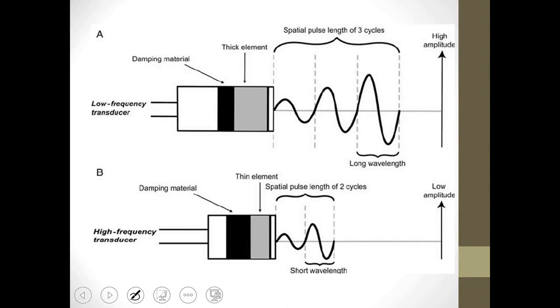It will stop completely. So you have indeed applied damping to the vibrations of your crystal. The damping block located behind the crystal serves to dampen or stop the vibrations of the crystal. There are two types of damping, light damping and heavy damping. Heavy damping is like stopping completely, meaning the pulse didn't take its time, it just barely produced the pulse. So you applied heavy damping, which means it stopped immediately.